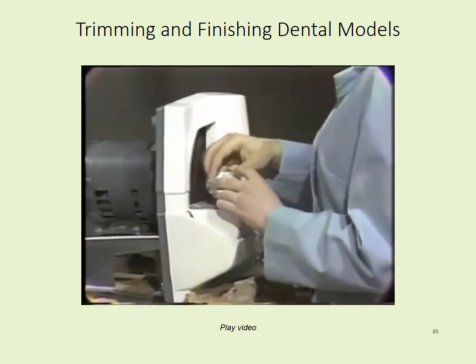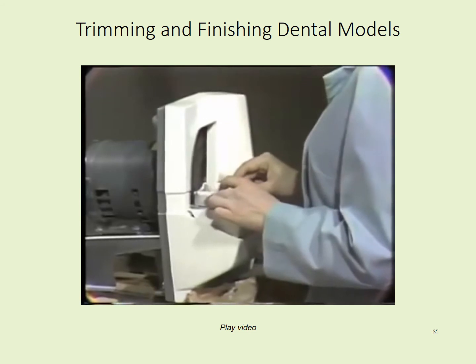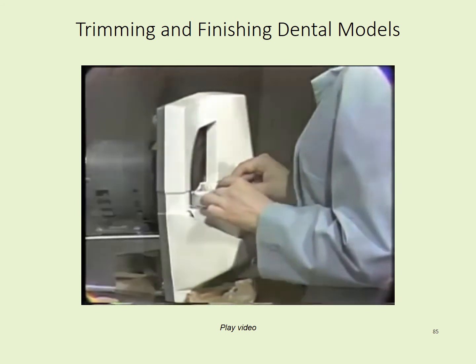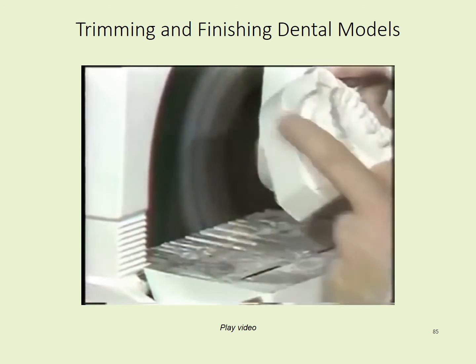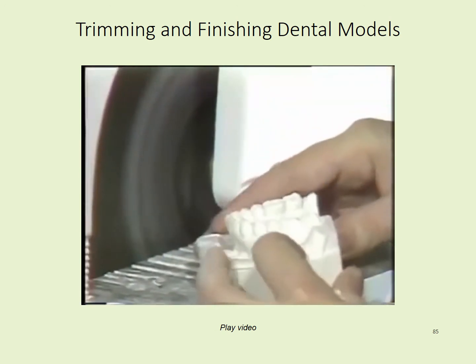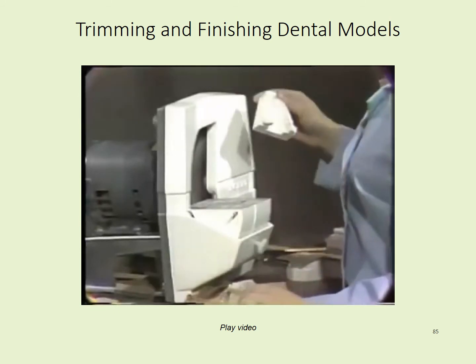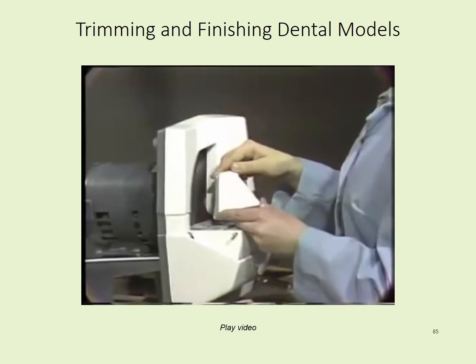The next step is to trim the sides. You will do this in the same manner as you trim the sides of the maxillary cast. You'll notice that I've trimmed down a little bit the sides of the cast so that it would fit in the model trimmer. I have a pre-trimmed cast here to show you how the completed trim of the sides should look.